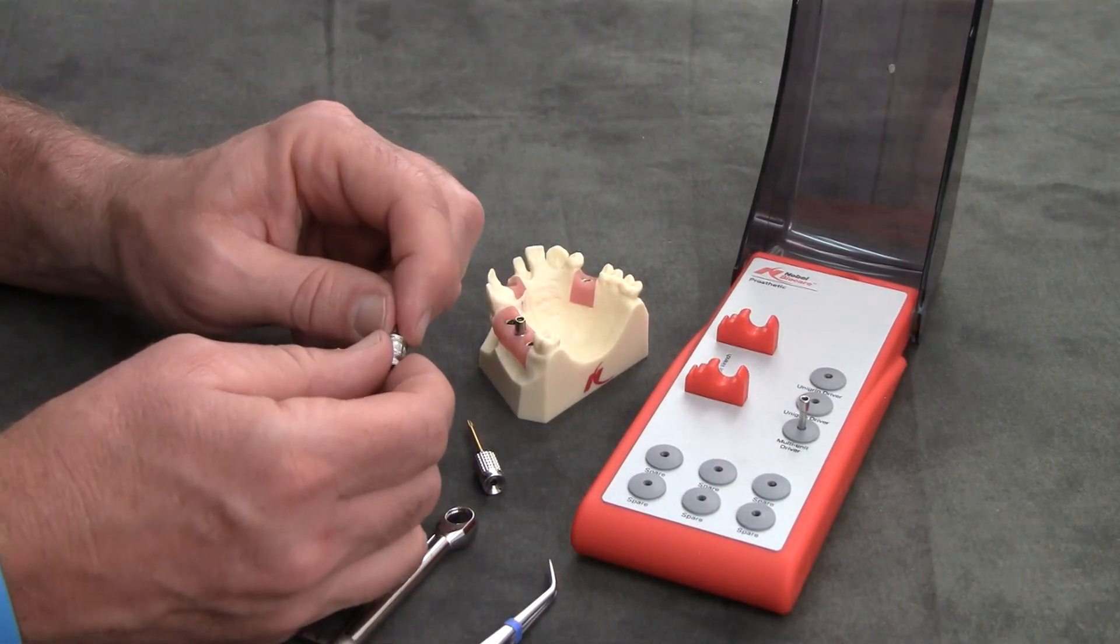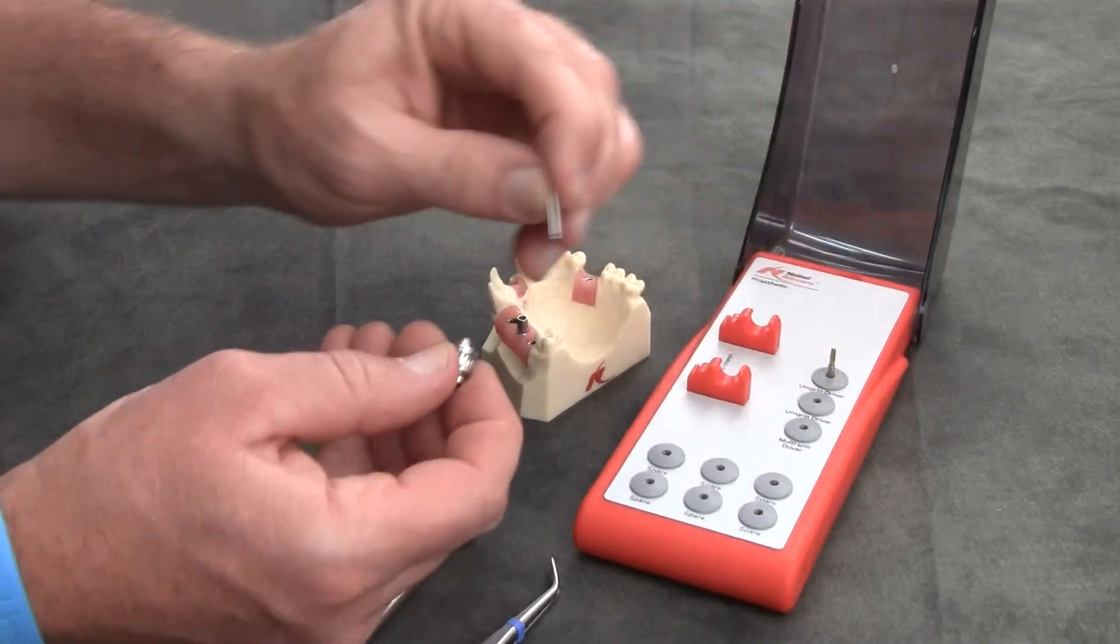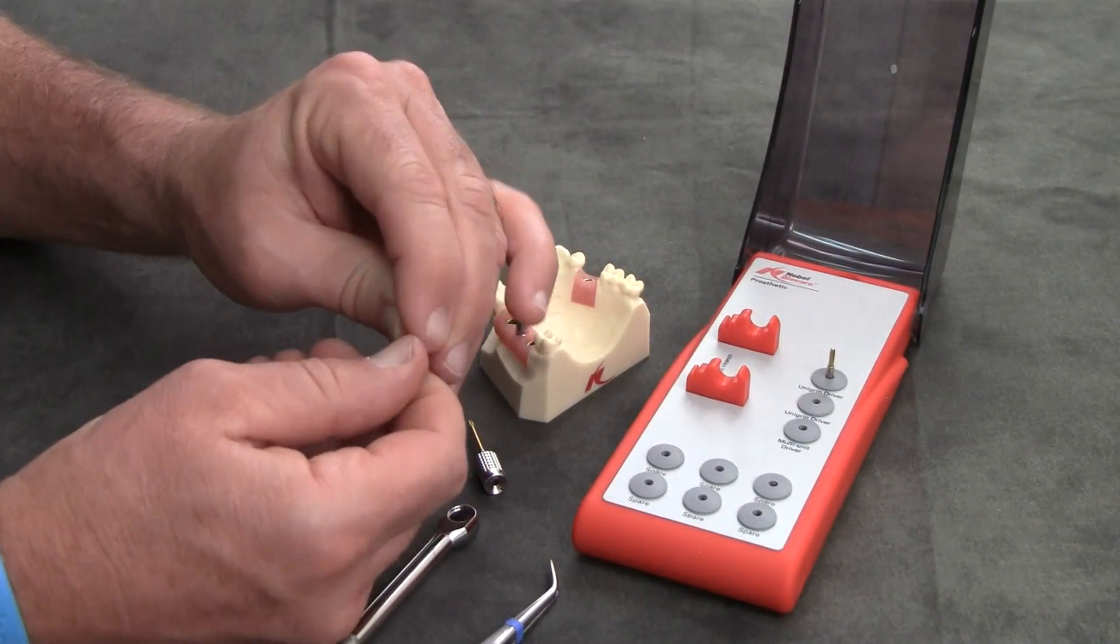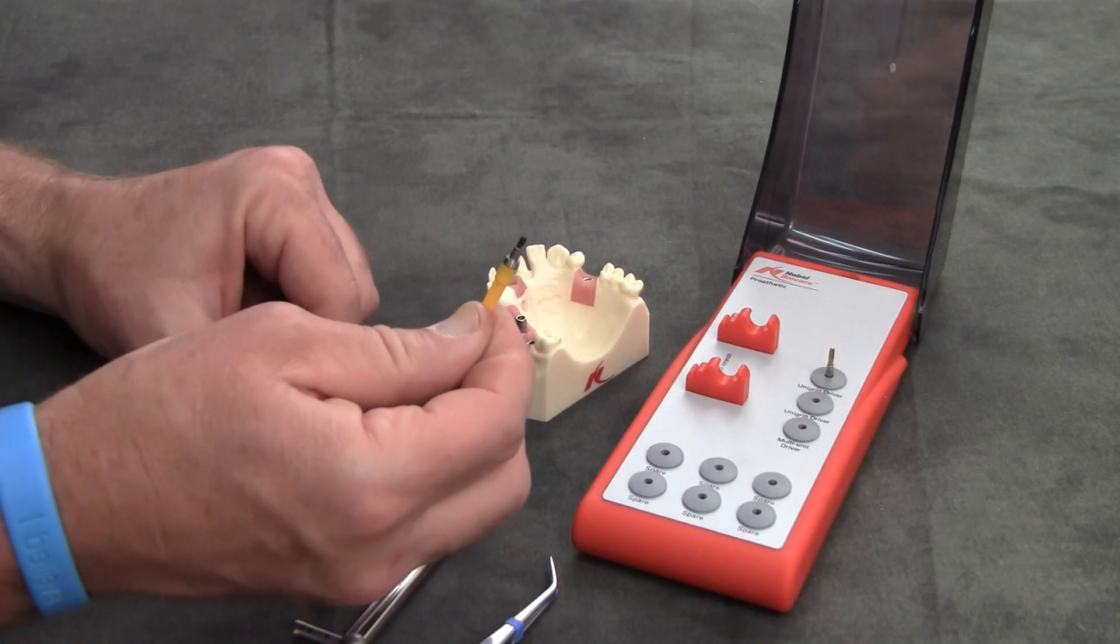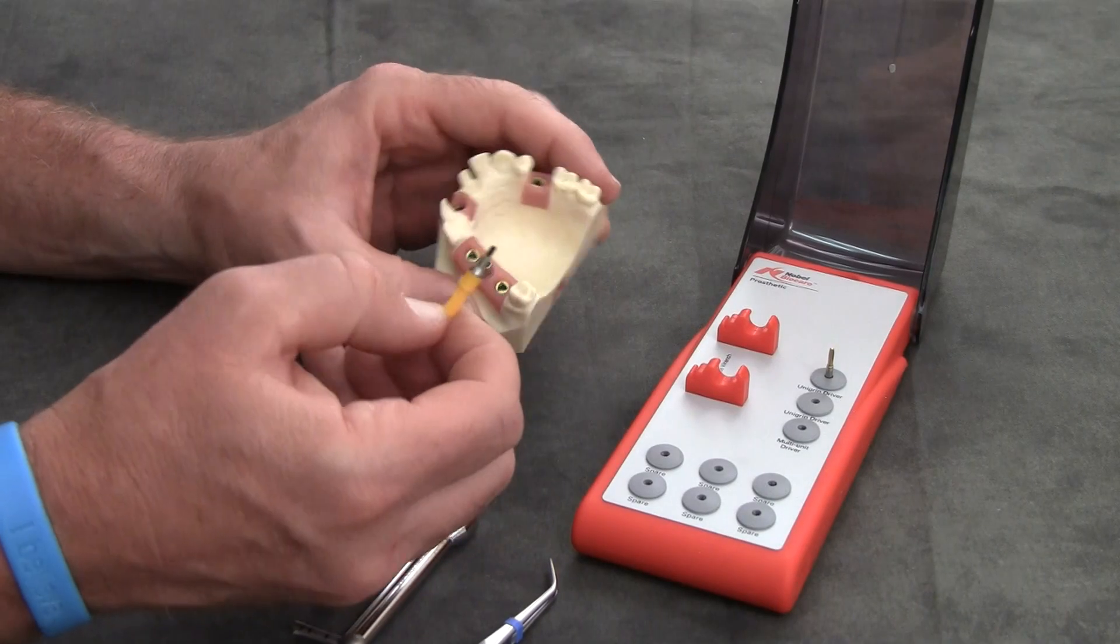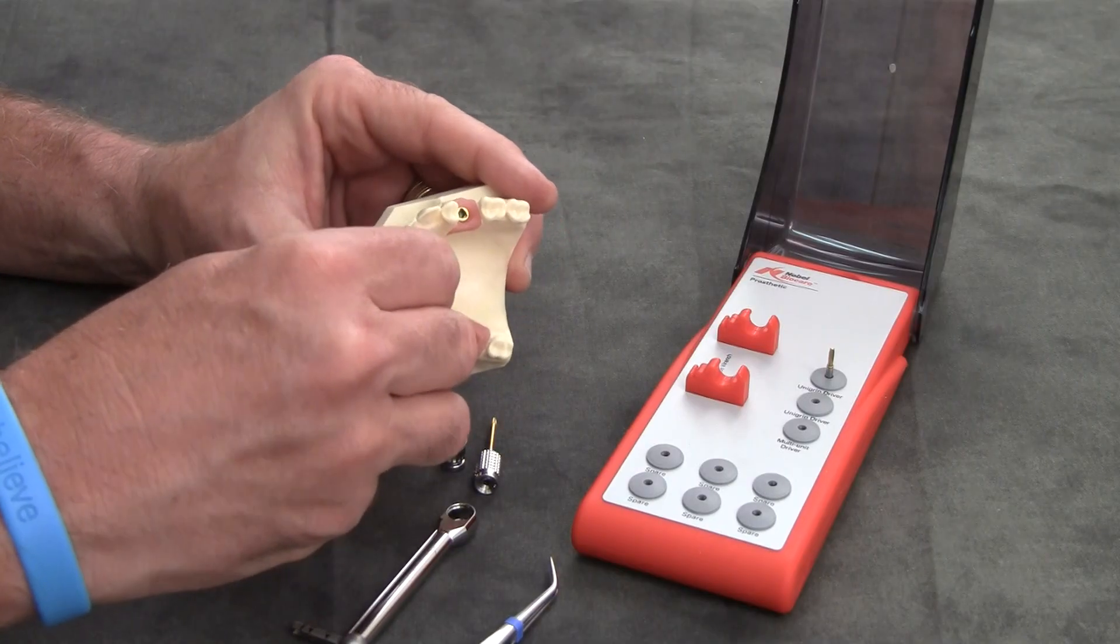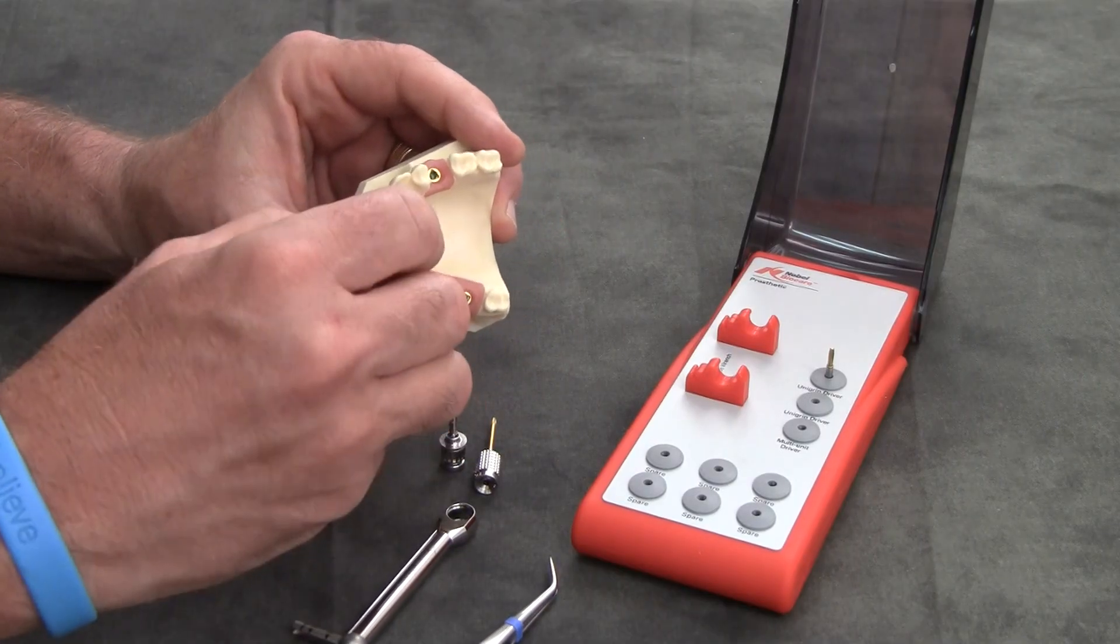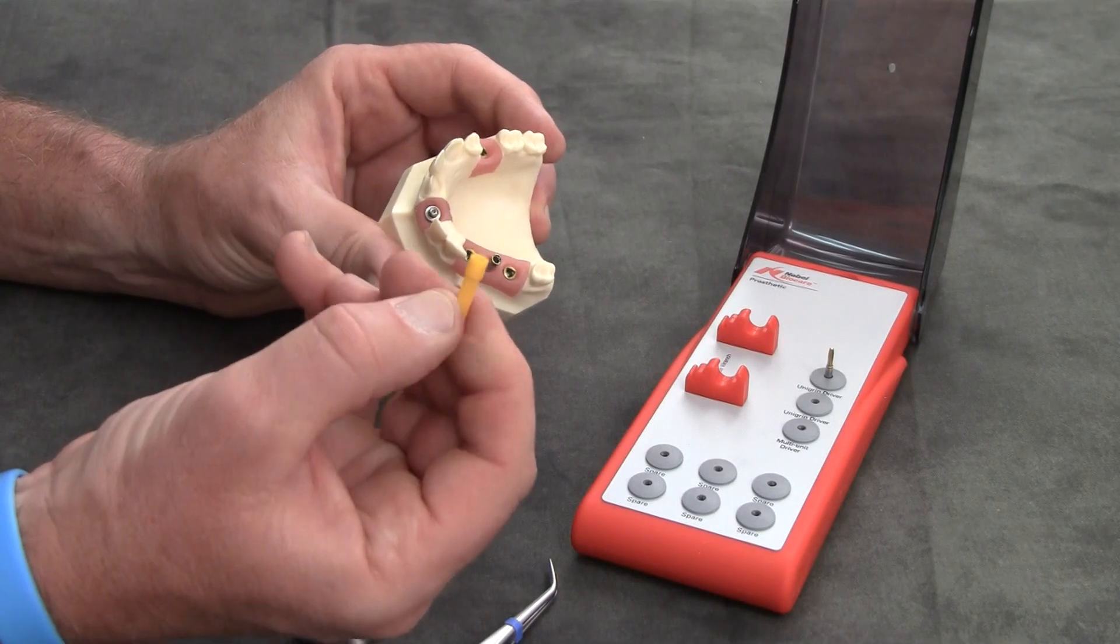The multi-unit insert can be utilized in this way. You can start by hand with a hand adapter. Our straight multi-unit abutments come with this plastic carrier. Simply take it to the site and screw in as much as you can by hand. This will come off.